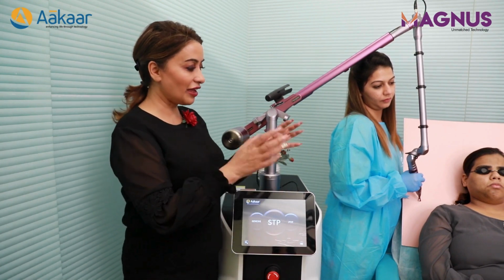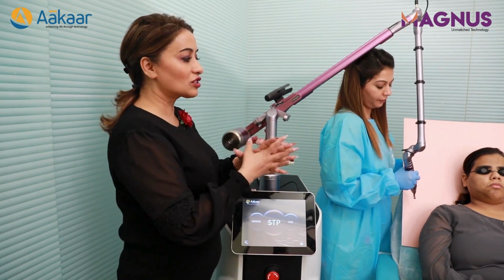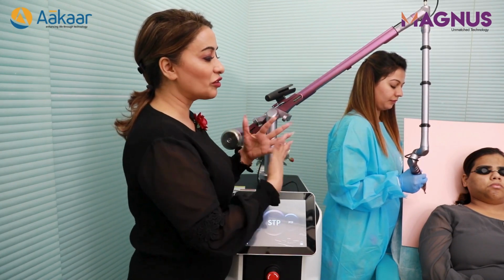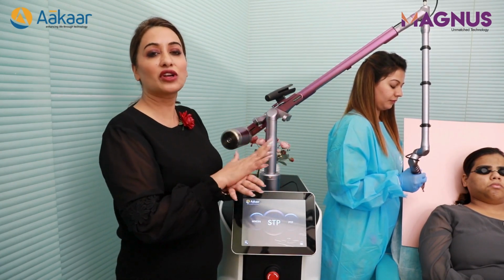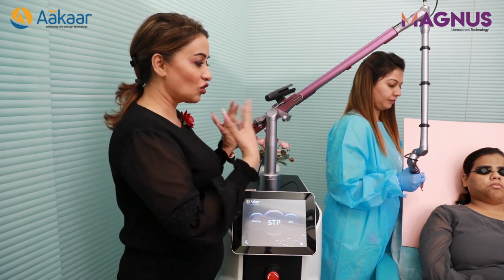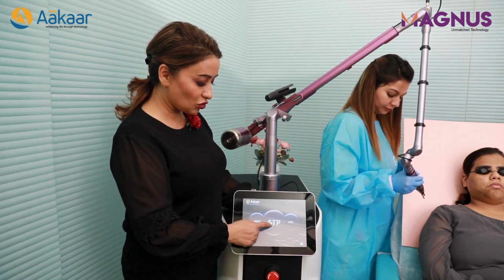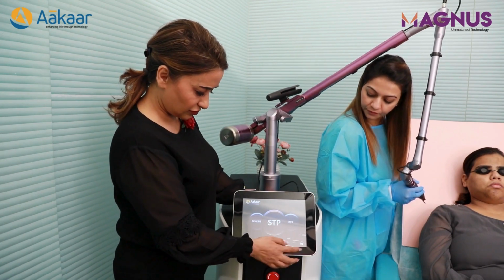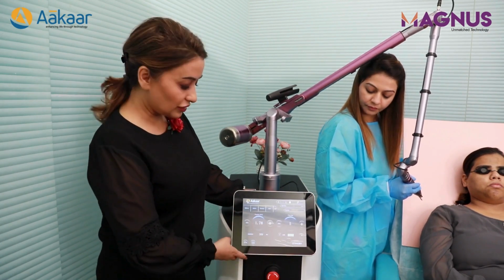So here I have a patient, as you can see, she's got some acne scars, open pores, and a bit of pigmentation. The right side of the face may appear a bit darker. We have just put a carbon emulsion there to do the carbon toning. So we are going to use STP mode here. Now this is the screen.